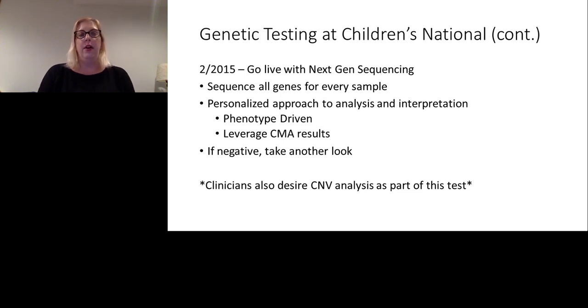Following our go-live of chromosomal microarrays, we proceeded to in-source next-gen sequencing. In 2015, we went live with next-gen sequencing. Our approach was to use a medical exome kit as opposed to going live with whole exome sequencing. In our laboratory setting, we treat all samples the same on the wet bench and sequence all genes for every sample. We then bioinformatically filtered the genes to only those that were ordered for the patient.